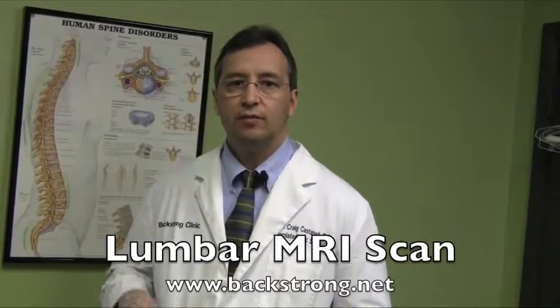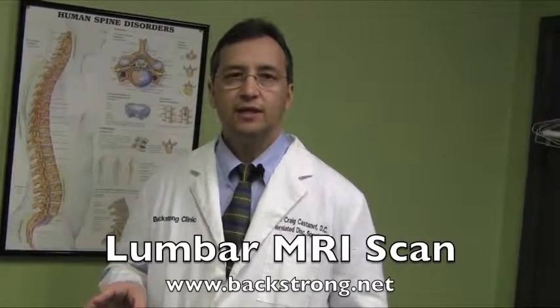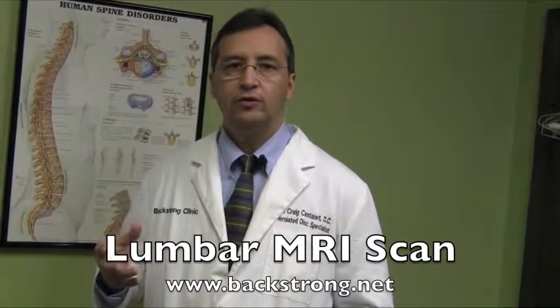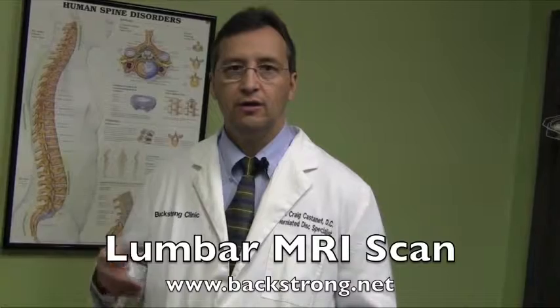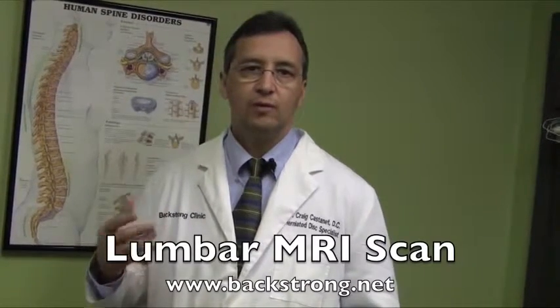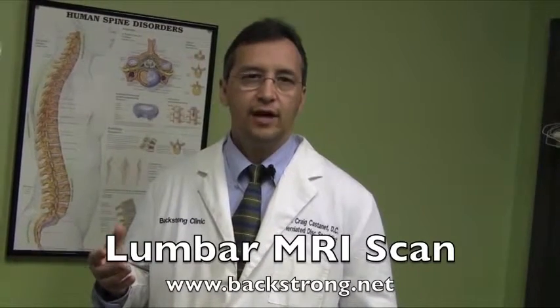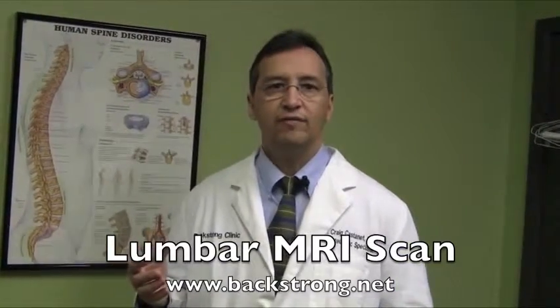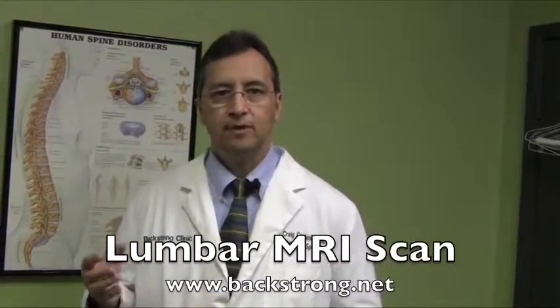I'm going to review some lumbar and cervical MRI films, teach you a little bit about the anatomy of the back and neck and what goes wrong, what degenerative conditions occur, define them for you, try to provide you a better understanding of them, and then tell you how we provide non-surgical treatment in a unique and I think more efficacious treatment than most clinics.